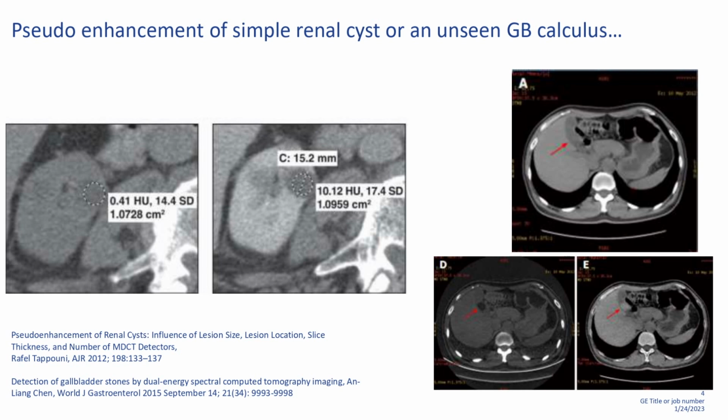The inadequacy of normal CT is that it was not able to differentiate attenuations very well. So, for example, when you have done an angio, you may see calcium and the blood vessel both having the same density. Many times calcium gets into the blood vessel and you are unable to measure the proper stenosis there. Why is this happening? We call it calcium blooming. This is because attenuations are overlapping. But if you can make an iodine alone image, then what will you see? Only iodine. You will not see the calcium. So you will be able to measure it better. So this is the reason why we have introduced dual energy CT, to overcome the inadequacy of a normal CT.